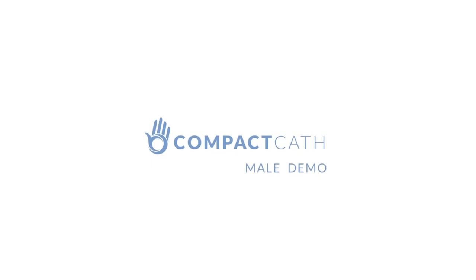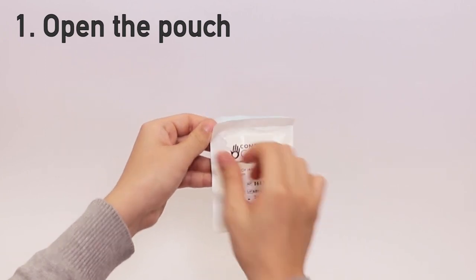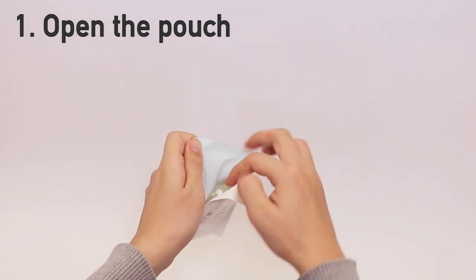This short video will teach you how to use compact cath. Open the pouch by peeling back the blue layer from the white and take the catheter out of the pouch.